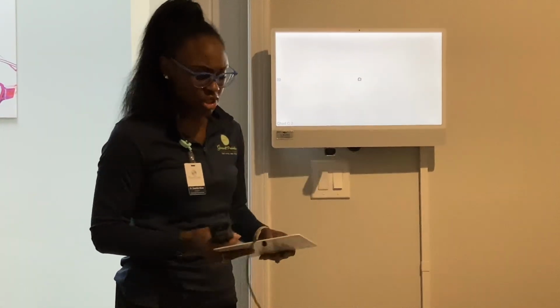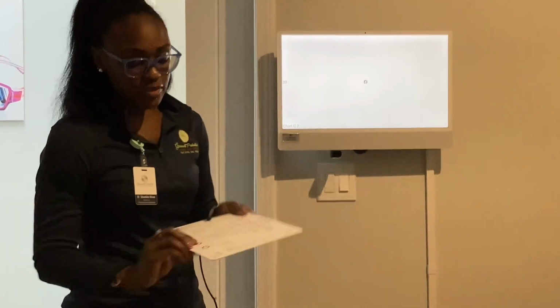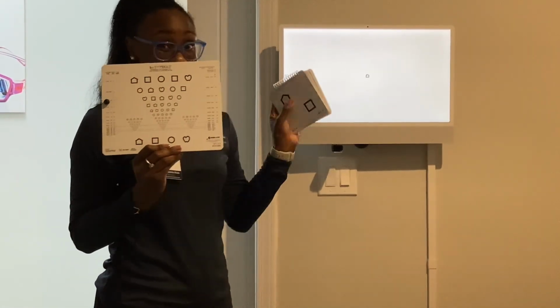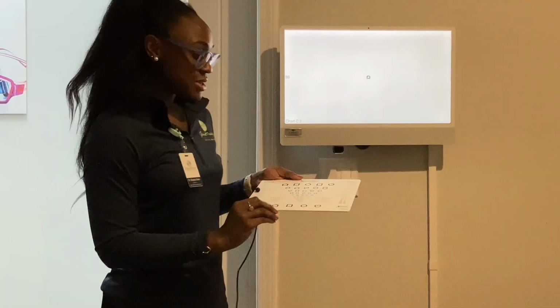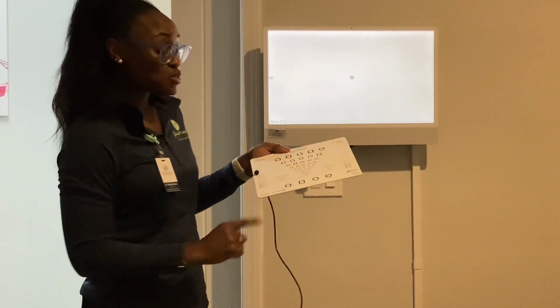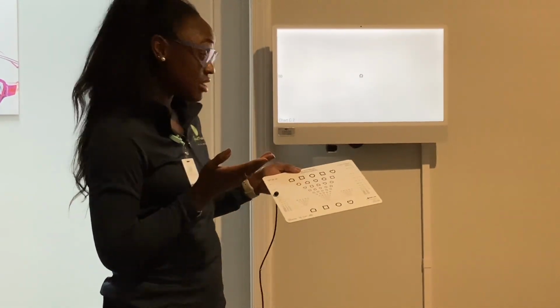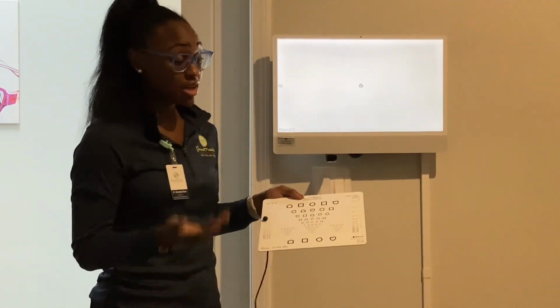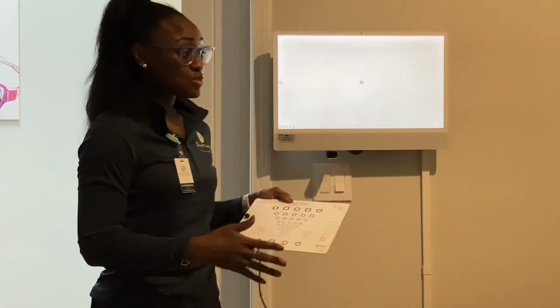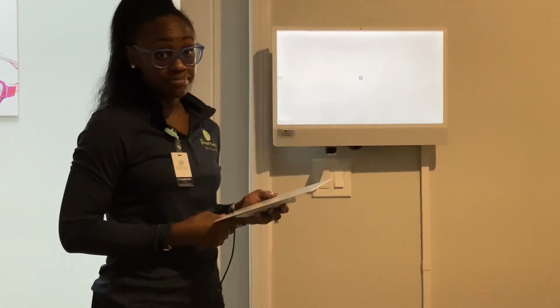If they need to match because they're nonverbal or they just don't really understand shapes quite yet, you can use 2 different things. They're both the same thing. You show them this board. These are Leah symbols. All you can do is say, look at the shape on the TV. Show me which one of these does it look like. If it looks like they're understanding, let's keep moving forward. If they do not understand that as well, then this level of testing is not appropriate for the child. Thank you.